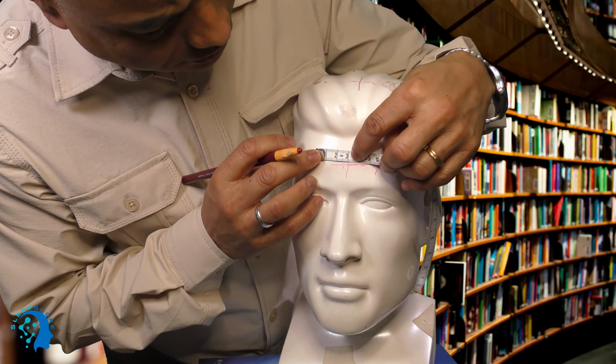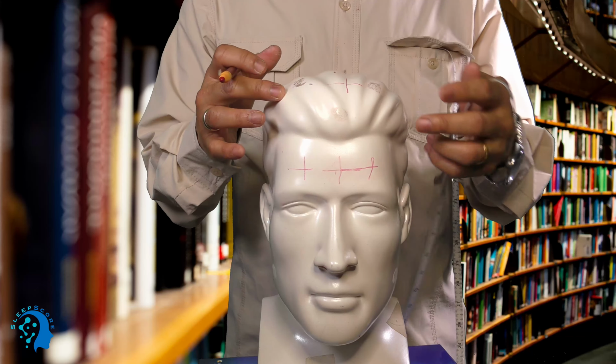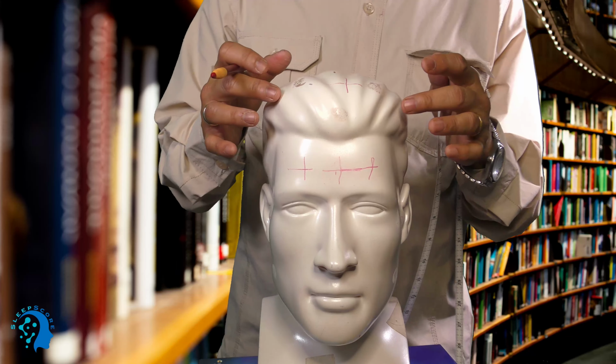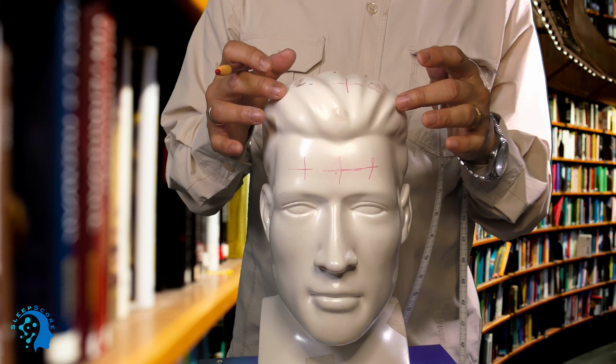Okay, so in that way I got my FP1 on the left side and FP2 on my right side. Before this, I told you we don't need FP1 and FP2 to do the hookup, but to find F3 and F4, we need to measure this one too. Now I'm in the process of measuring F3 and F4.